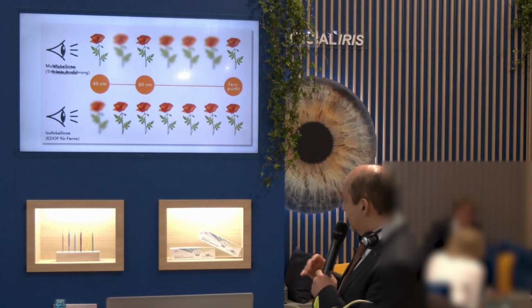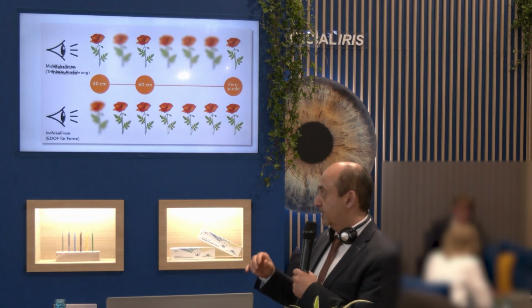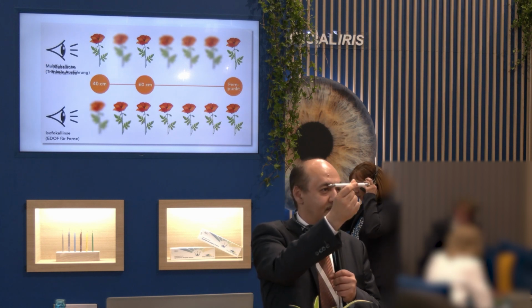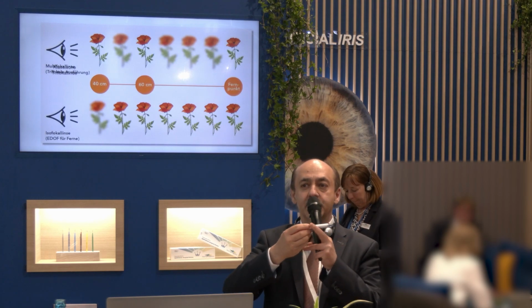If we look at the principle of the 2 types of lenses, at the bottom is the so-called isofocal lens, also known as an EDOF lens. These lenses do not have a point image, but rather a line image. When you look at a pen from the front, it is always a point. When you look at it from the side, it is a line. And this is the principle of isofocality. This means you extend your focal point along an axis.